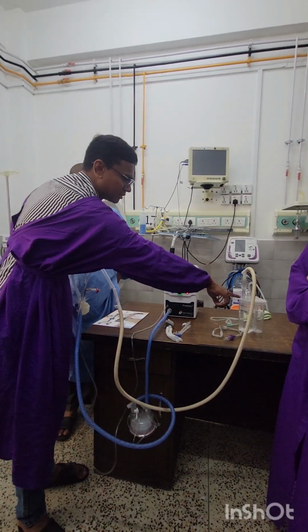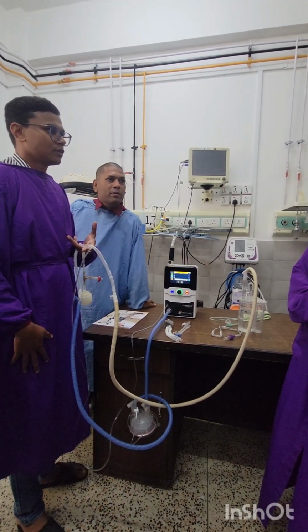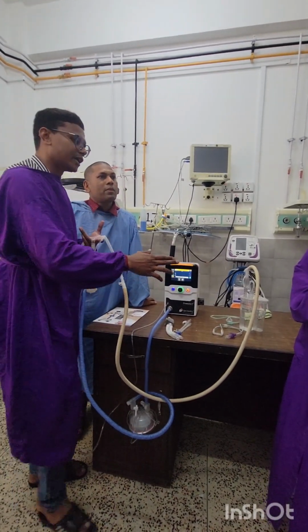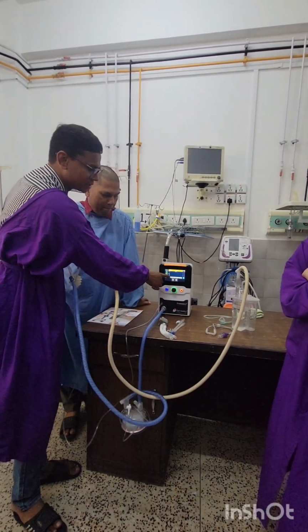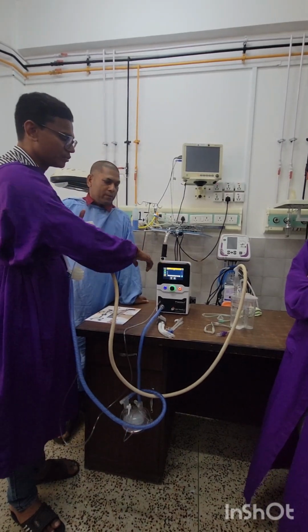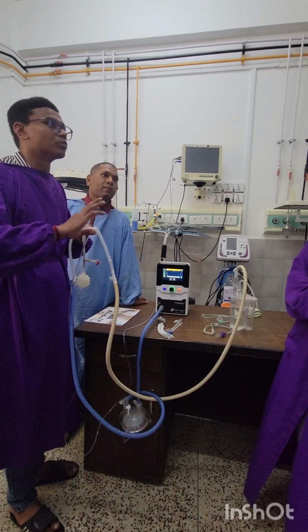While we have kept 6 cm H2O here, it is delivering 4.5. So if you don't have a monitoring system with you, you always believe that your CPAP pressure is 6. But with the help of this monitoring, you can realize that the CPAP pressure is actually 4.5. Right? So with the help of this real-time monitoring, you can check and treat your baby accordingly. You can change your protocols and everything.